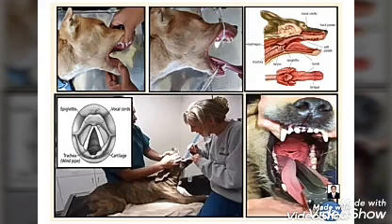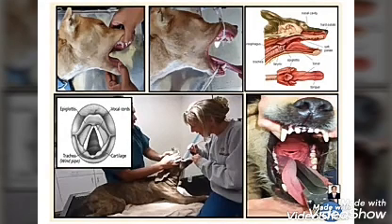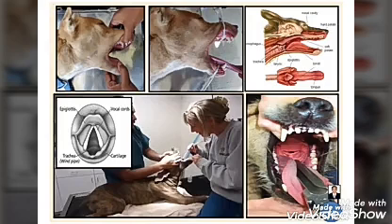When you press in the ventral direction, there is a chance of disturbing the anatomy of the larynx, and you cannot visualize properly.